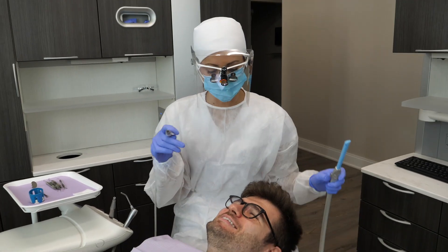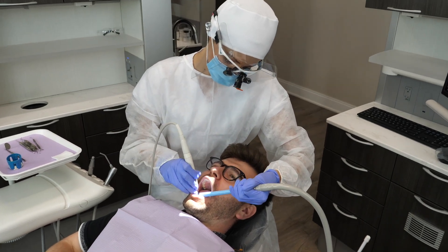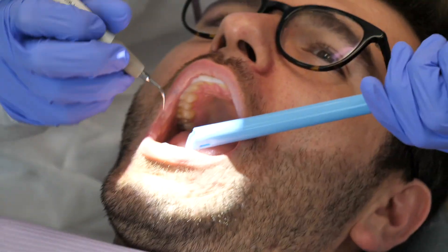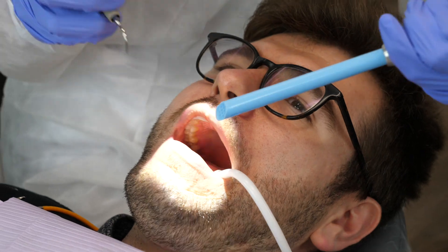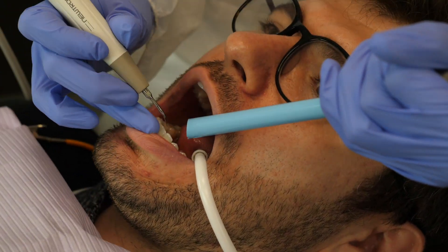Whenever there is a super difficult piece of calculus to remove, I still go back to what a random senior dental hygiene student told me when I was a freshman preparing for a clinical exam in school. She said to use everything you've got and see what works. So to this day, if there is a difficult piece of calculus, I do just that.